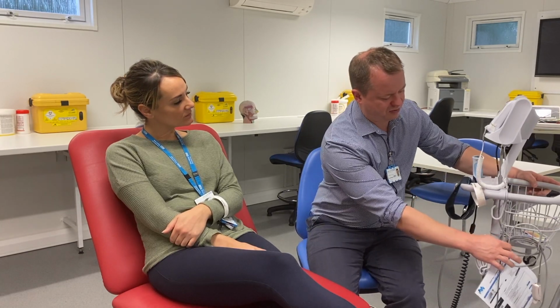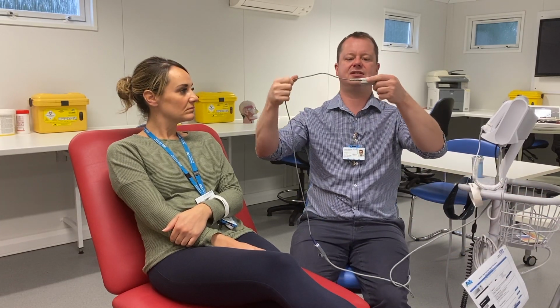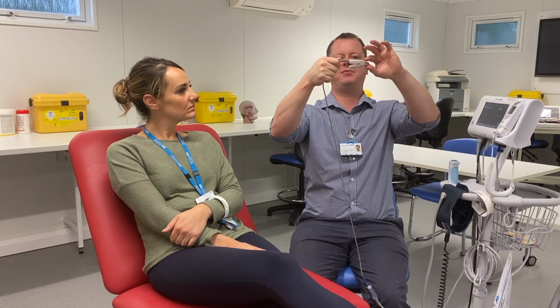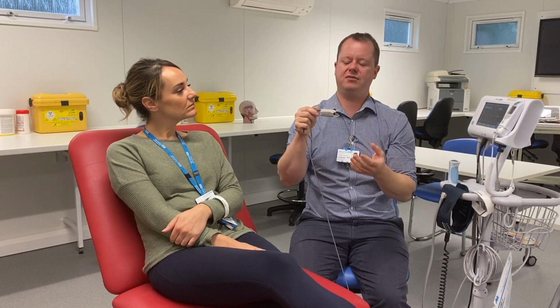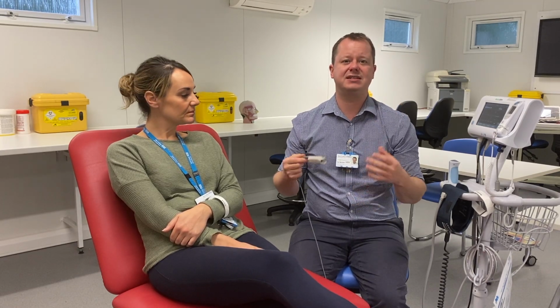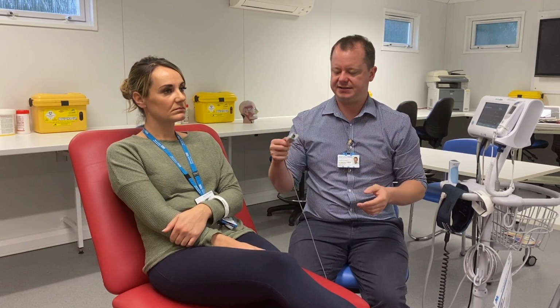If I want to record the saturations of oxygen of this patient, I'm going to need to use a SATS probe, which is attached to the side of the OBS machine. This SATS probe is essentially a finger probe that if you squeeze the end, it opens up, and you can see there's a little red light inside there. That will shine a light through the finger, and what it's going to record is the amount of red blood cells that are saturated with oxygen. Most humans hover between 94 and 98.